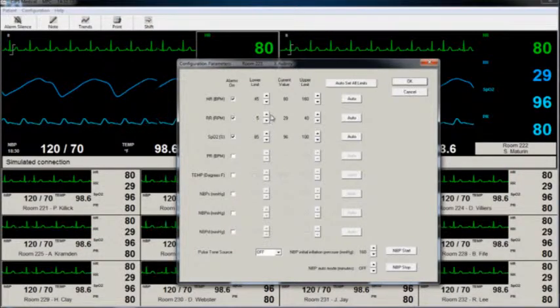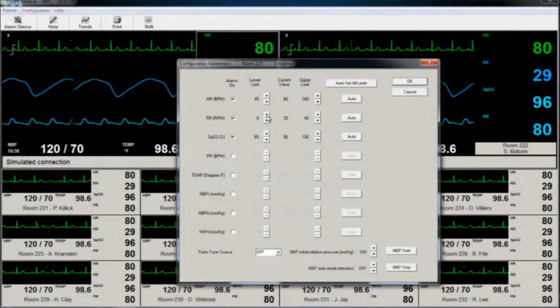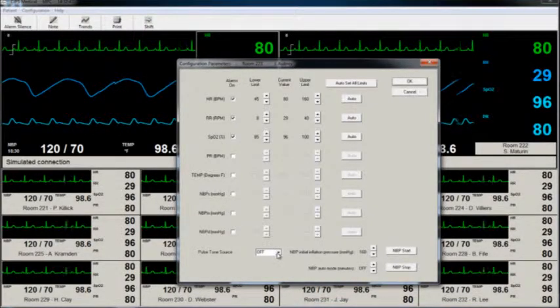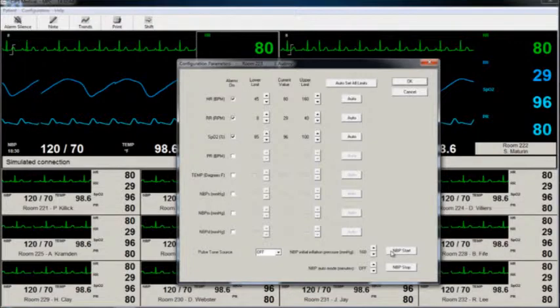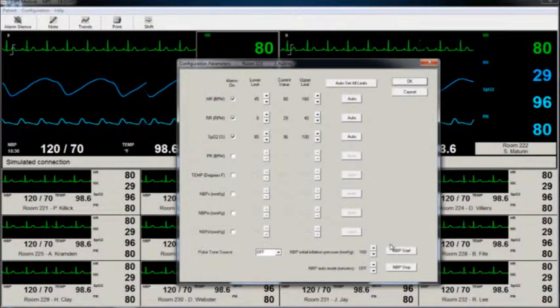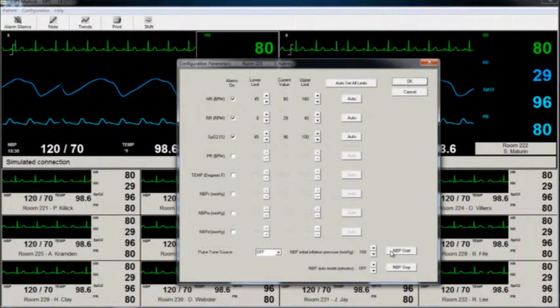The user can also choose to set the pulse tone on or off on a per-patient basis, simply by selecting that option. The clinician can also initiate a blood pressure measurement or select a time interval for such a measurement from once every 3 minutes to every 120 minutes.